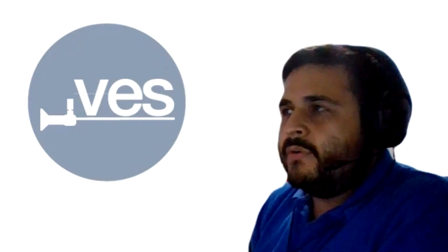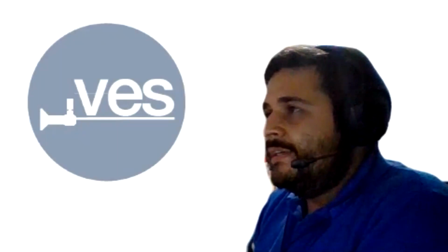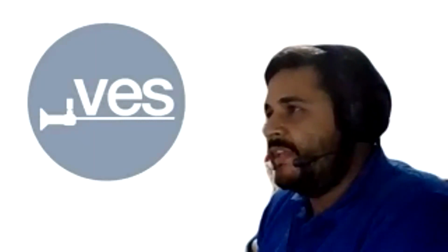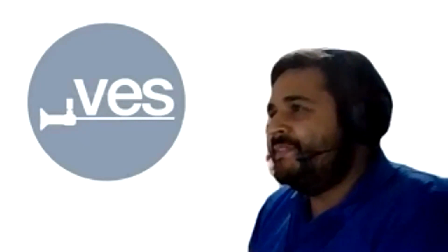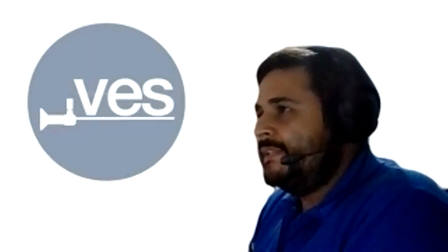I'm a big fan of harmonic devices, and I think this is a good way to do some cats. I use that. I never use clips or other things in these cases with this tiny, tiny little cava. It's very challenging, but with the harmonic devices, it's all right. I don't have any problems with that. It surely is a good recommendation for these cases.